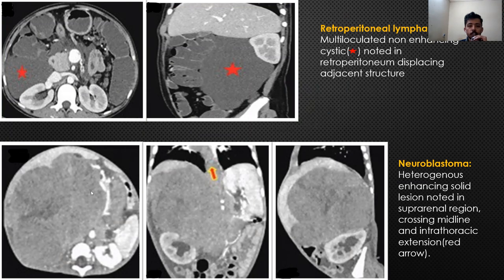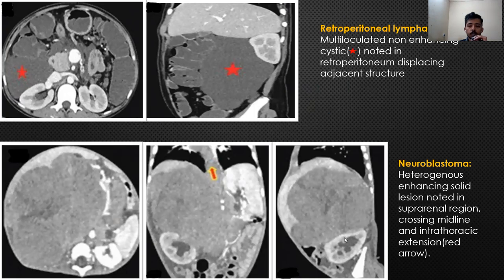Another case showed a large heterogeneous lesion displacing the vascular structures, with evidence of intrathoracic extension displacing the right kidney inferiorly. There was non-visualization of the suprarenal gland, giving an appearance of a phantom organ sign in a case of neuroblastoma.